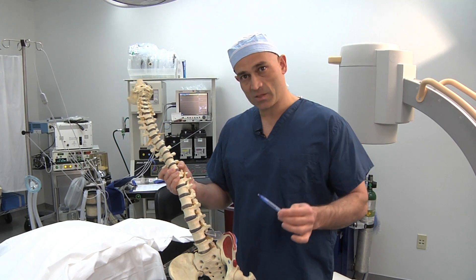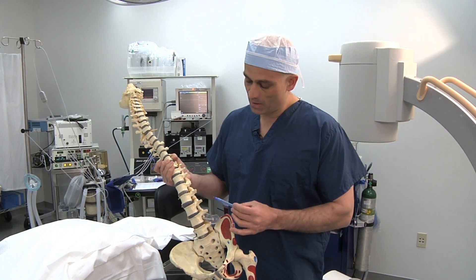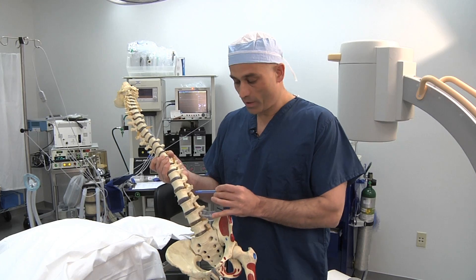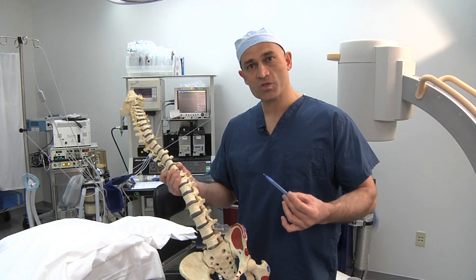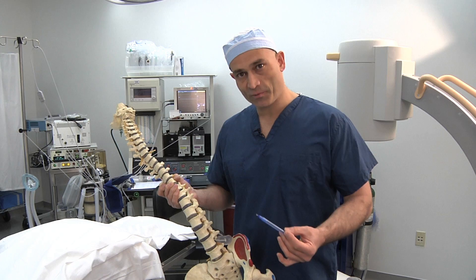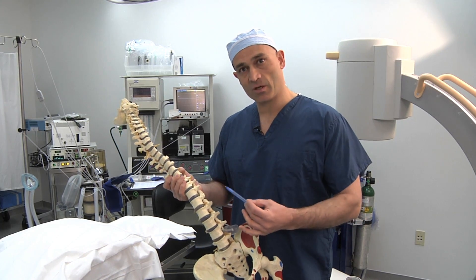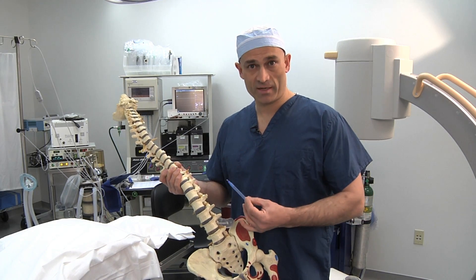What we're going to do today is take a specialized needle called a radiofrequency needle and, under x-ray guidance, place the needle just into the neuroforaminal space. We're going to heat the tip of the needle, and by doing so, this causes a destruction of some of the pain-carrying fibres, which leads to an improvement in patient symptoms. This procedure is carried out with fluoroscopic guidance, which makes it a lot safer and leads to a greater rate of effectiveness.